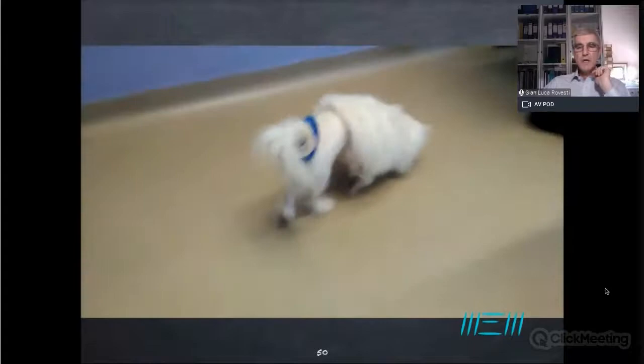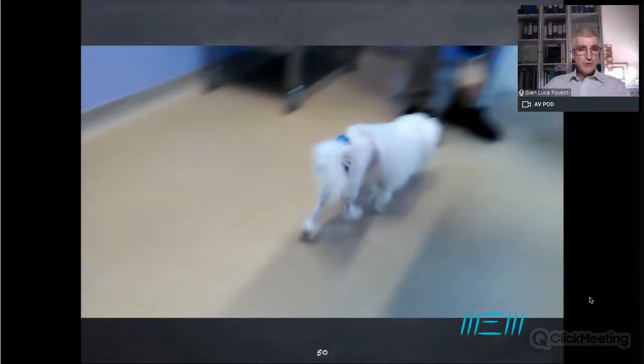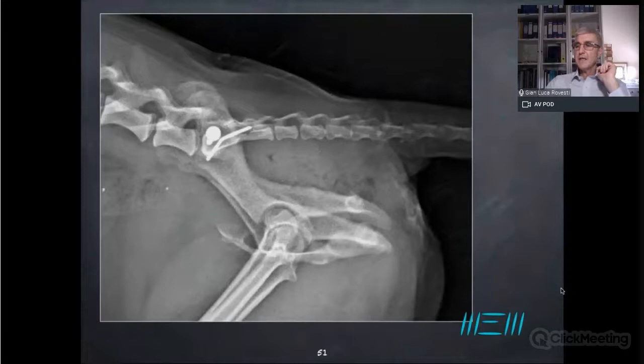Already, the management of the fixator is like the management of other external fixators, meaning the protection, the bandage, is not to protect the fixator, it is to prevent the dog from getting caught in furniture, in fences, etc. So it shouldn't get caught, okay? And after 4 or 5 weeks, we can check that everything is correctly in place like this, and we can remove the fixator.